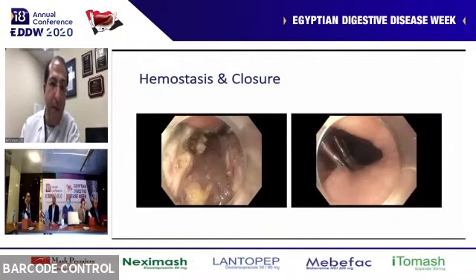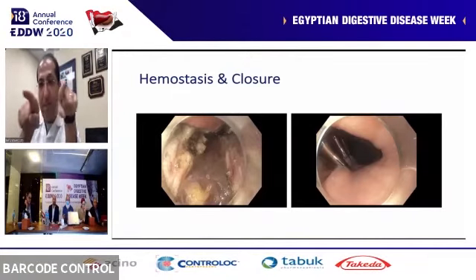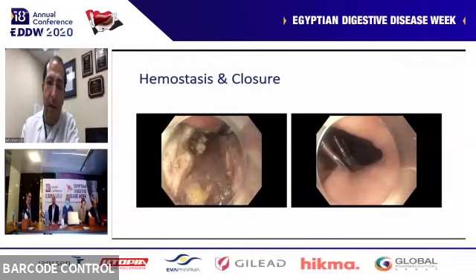After the myotomy is completed, you make sure there's no bleeding within your tunnel. In this picture to the left, you see at 12 o'clock this is mucosa prolapsing down. It looks intact. The muscle is split open, and then you see adventitia or mediastinal cavity at the bottom. We close the entry to the tunnel, to the esophagus, and then you have a completed myotomy.